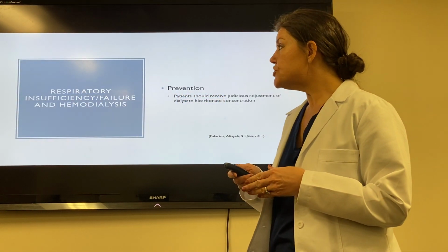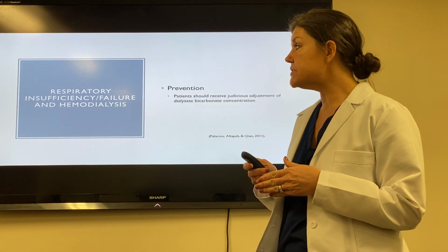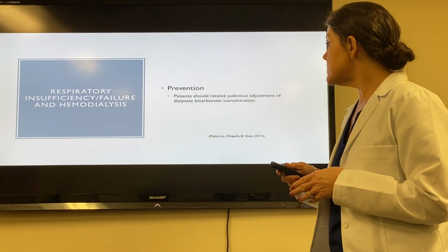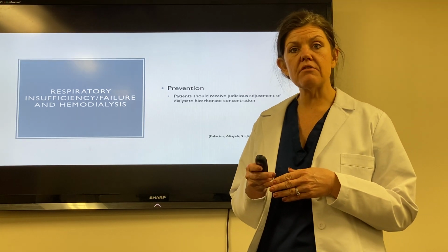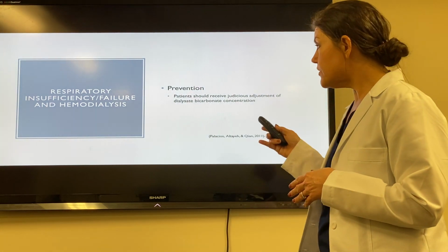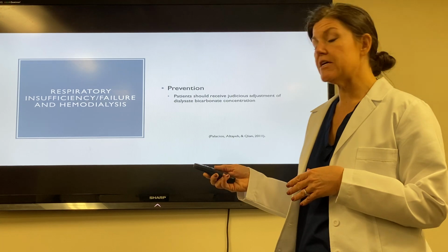So what should we be doing for these patients to prevent these respiratory insufficiency and failures during hemodialysis? Patients should receive judicious adjustments of the dialysate bicarbonate concentration. Of course, this is up to the nephrologist and the dialysate orders, but we do have to be careful about the dialysate bicarbonate concentration with this patient population.